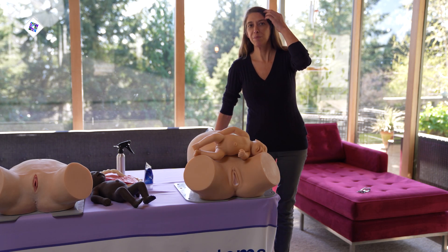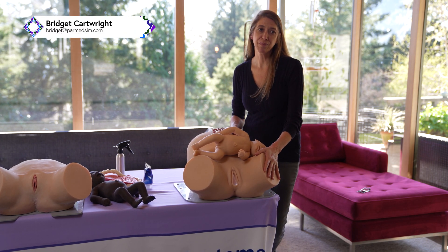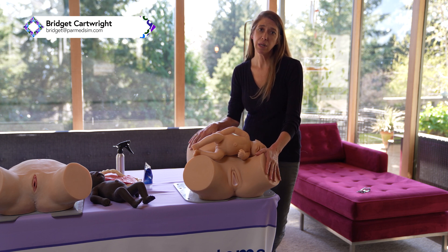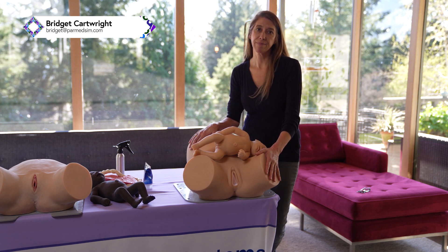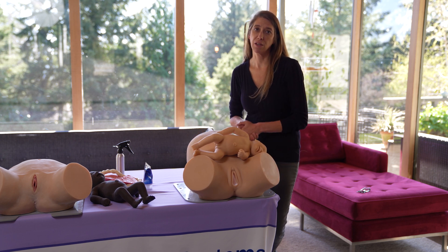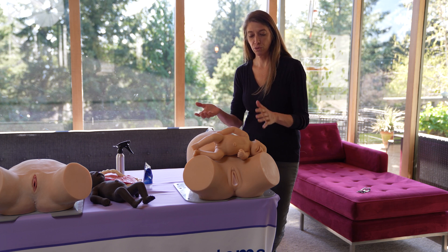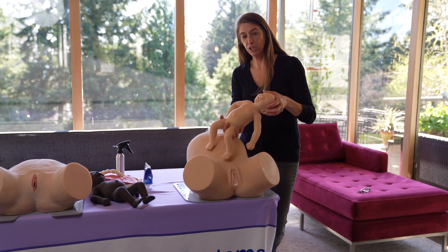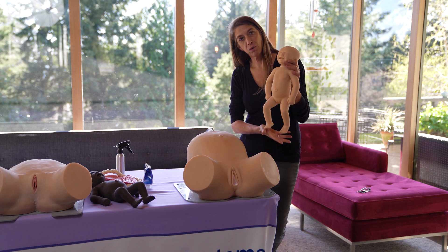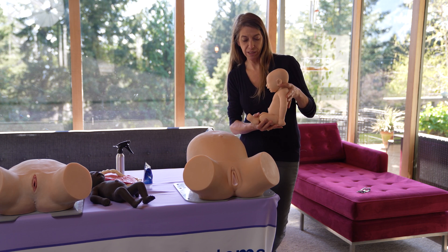Welcome to Paradigm Medical Systems virtual demo. During these times we're sad to not see you and we know that things are really different right now. We appreciate everything that you all are doing and we wanted to provide you a virtual demonstration so in case you are missing us as much as we are missing you, you can see what we have.